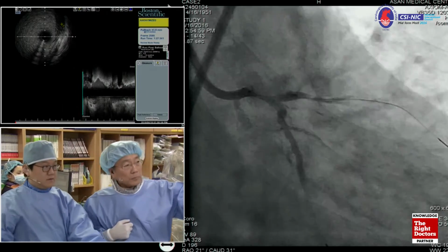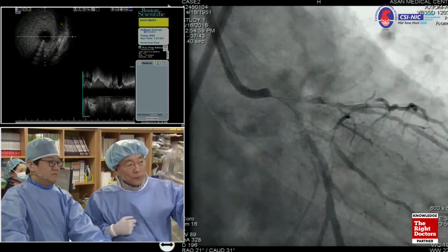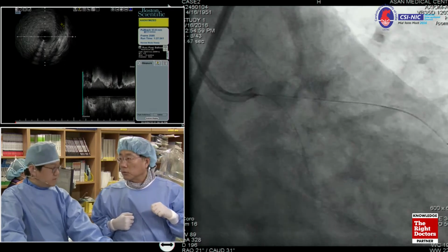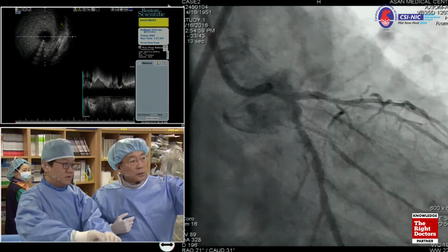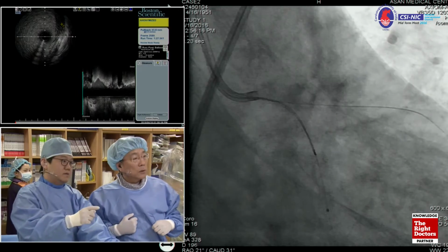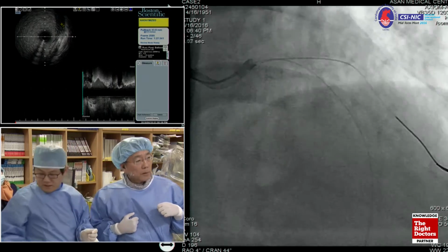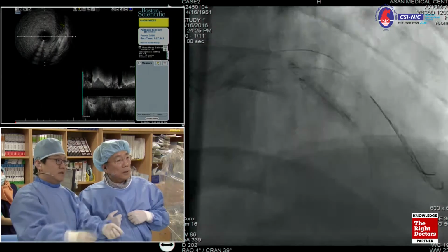And so, this is very complex, right? Yeah. Diffuse disease, however I am not too concerned. It's just a stent crush for that, right? Yes. What do you think? Two-stent technique? Yes, good. And for the stent landing zones for the LAD, next. Would you show us the previous one? Next. What do you think, Dr. Ahn? Because of limited time, we already put the one stent where? At the proximal LAD. Let's see. Here? Where? Next. Where was it? Yes. All right, good.